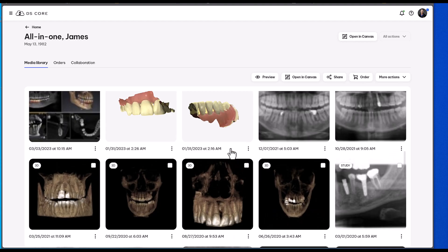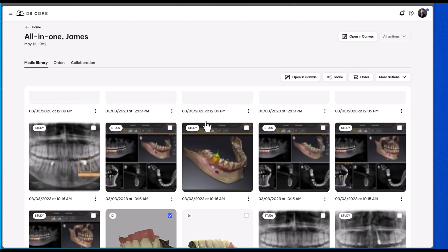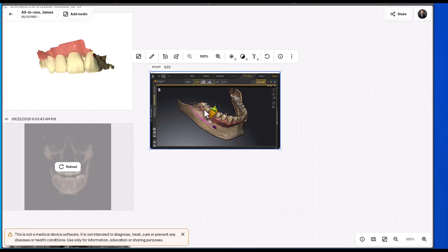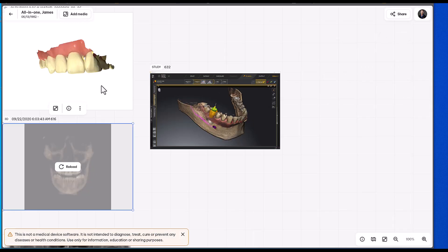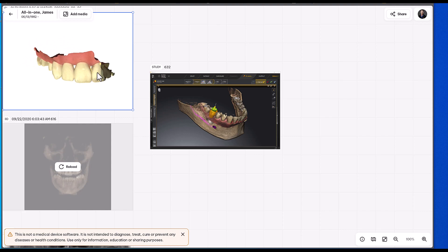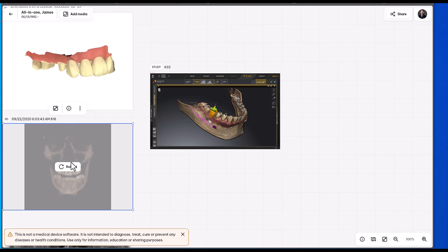You also have the ability to do something called Canvas. So let's say you have multiple different files that you've taken for that patient — let's say it's a cone beam, an implant plan that you've created, their file from the PrimeScan. You could go directly into the Canvas and view all those at once.